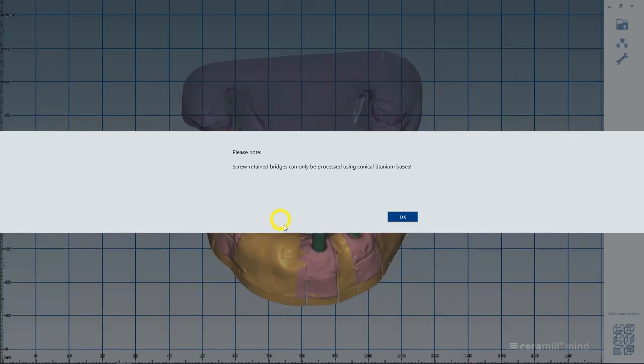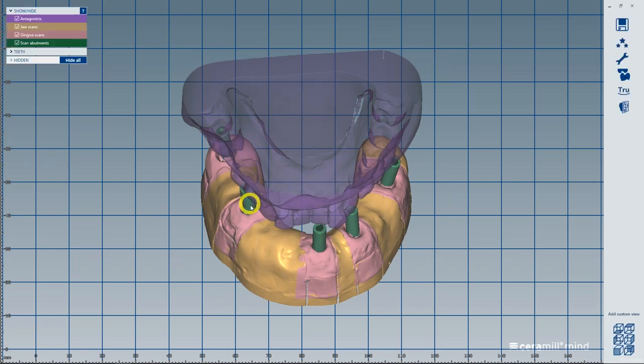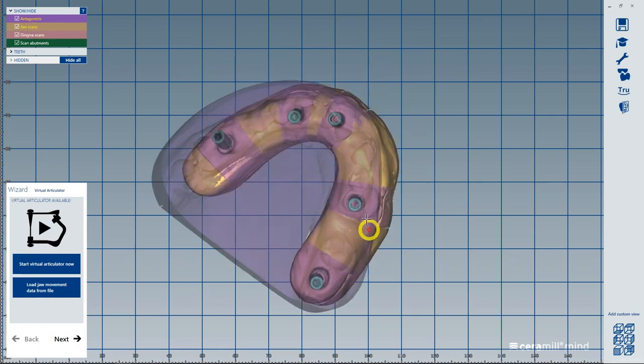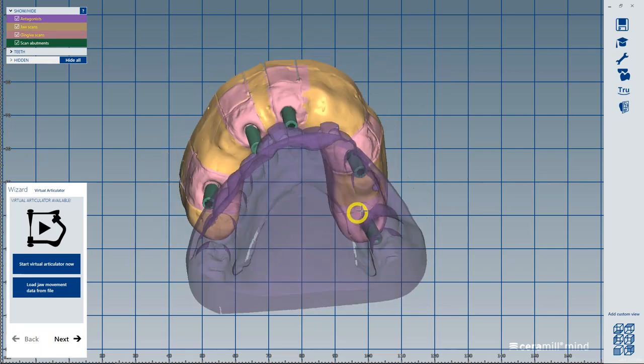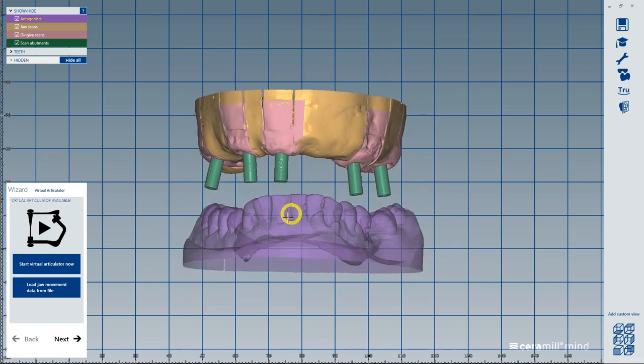This is also a good time to check and make sure your locations are correct. Your implant locations, your scan bodies are in the right position, your gingiva. You don't want to get deep into design and then find out something's off. So what I kind of do is I look around and I make sure everything's correct. And then we're going to go straight to our wizard. So the wizard or virtual articulator is the first step. So we're going to start articulator.